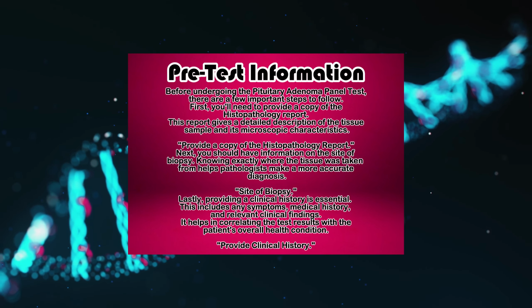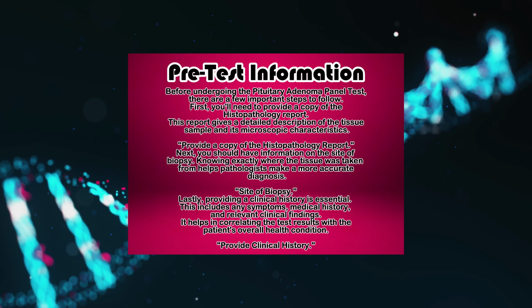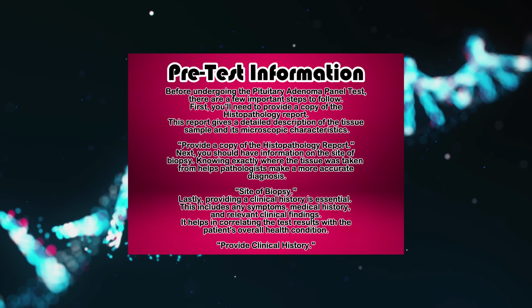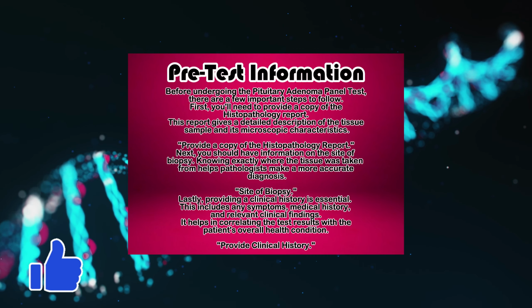Next, you should have information on the site of biopsy. Knowing exactly where the tissue was taken from helps pathologists make a more accurate diagnosis. Lastly, providing a clinical history is essential.